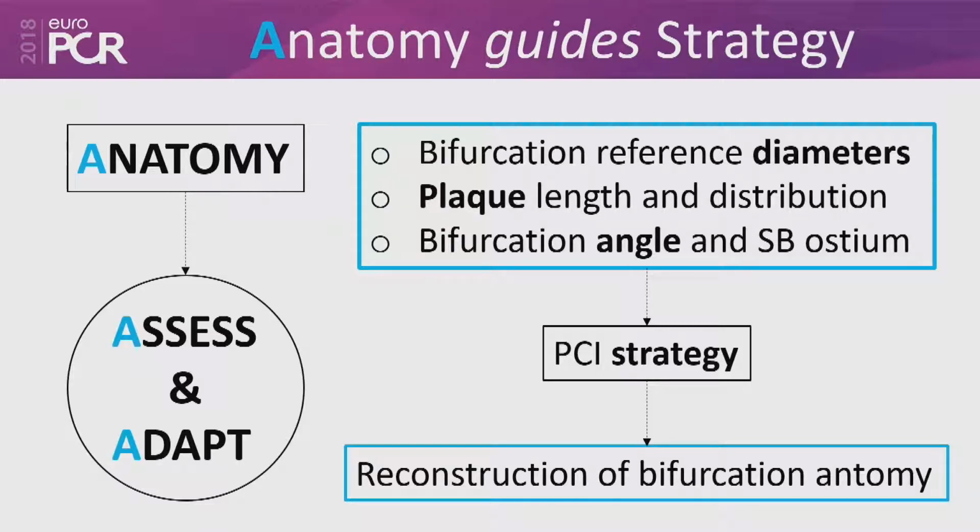Other question? If I'm doing a bifurcation stenting, I will always keep the side branch in mind much more. You would always protect the side branch, you say? Yeah, it's definitely a consideration. Indeed, it's the safest way to protect the side branch always, but indeed there are clinical scenarios when you are obliged to move fast.